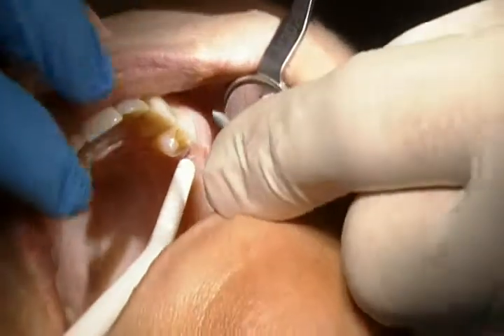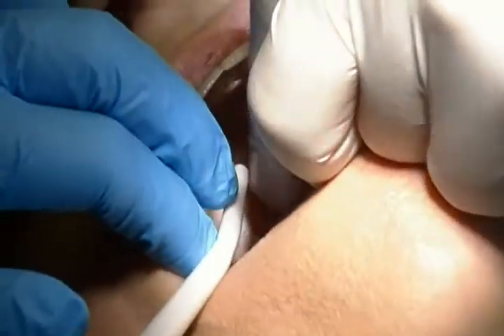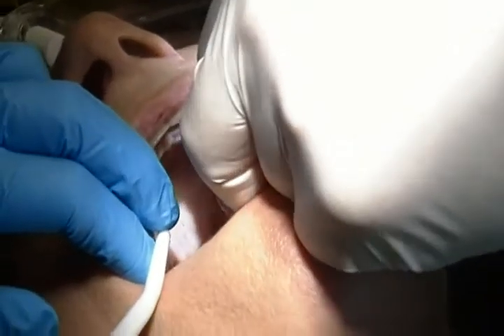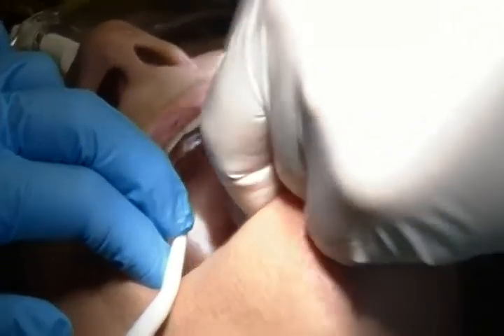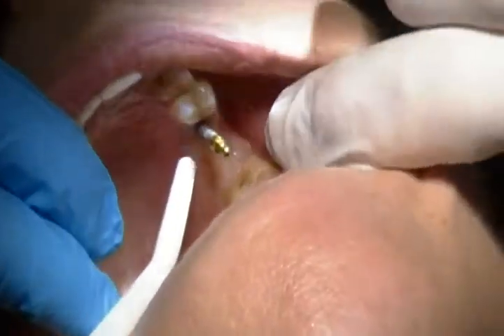Okay, I've got my implant. Back up, please. I'm just putting it in there. I know that I don't have a lot of bone, so I'm trying to make sure I keep it close to that tooth with the most bone. This is my angle.